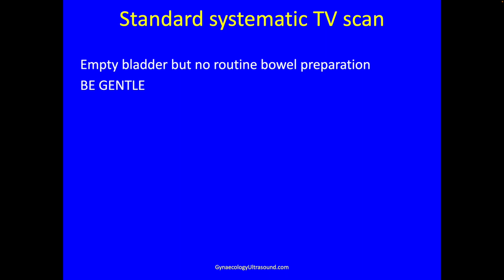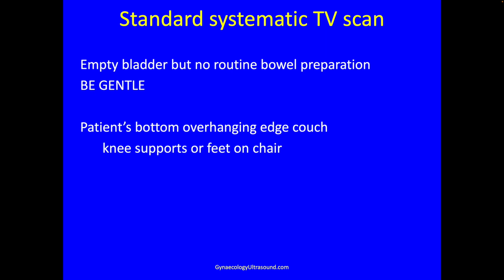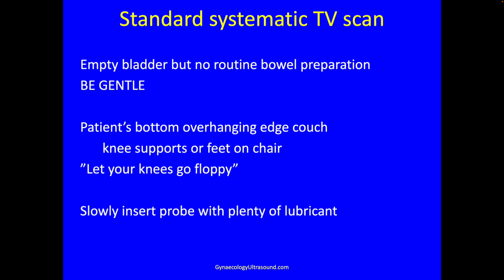Be very gentle. The gentler you are, the better you'll see, and the nicer it is for the patient, obviously. Patient's bottom should be overhanging the edge of a couch. I never ever use a wedge, and then use knee supports or have feet on a chair. And then I'll say, let your knees go floppy, and I'll say this repeatedly as it really helps you to look better and for the scan to be a lot less tender.